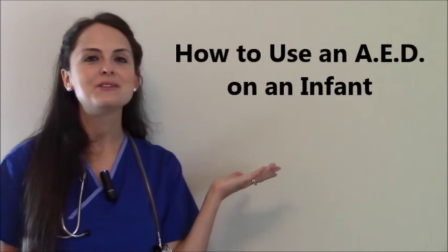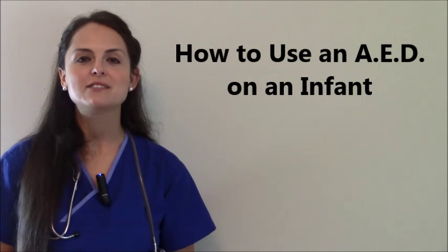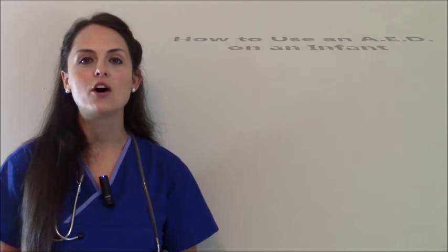Hey everyone, it's Sarah with RegisterNurseRN.com and in this video I want to go over how to use an AED on an infant. In my previous videos I went over how to use an AED on an adult, and in this video I want to demonstrate how you would do that on an infant. Before we begin, I want to go over some key concepts with you.